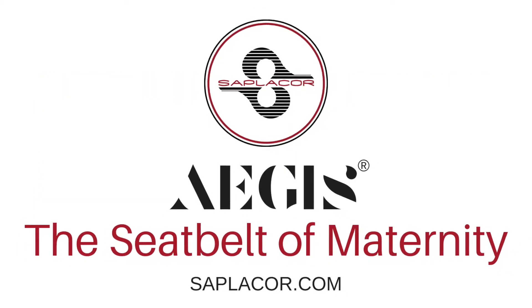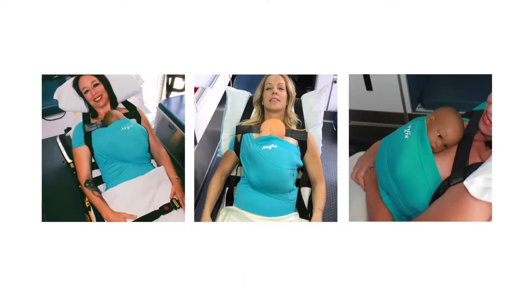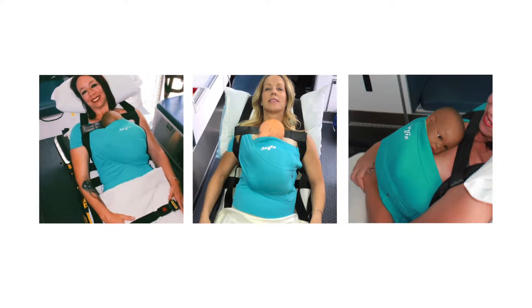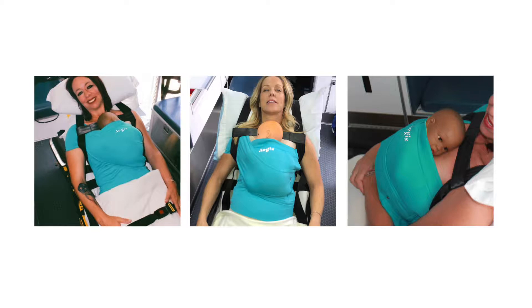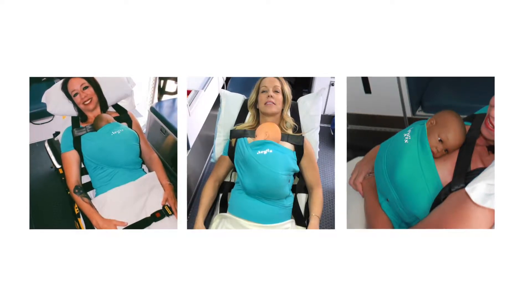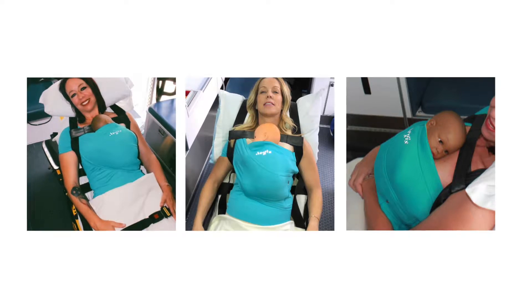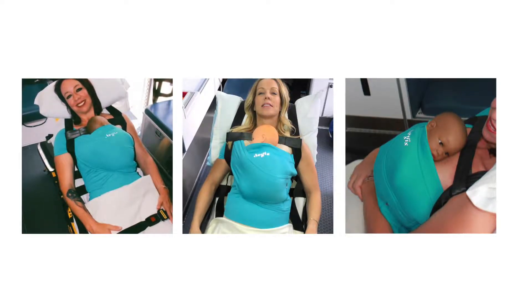Introducing Aegis, the seatbelt of maternity. An innovative disposable harness system that significantly improves safety for newborns during multi-patient ambulance transports to minimize the risk of injury. The Aegis Neonate Wrap restrains an infant skin to skin with mother.